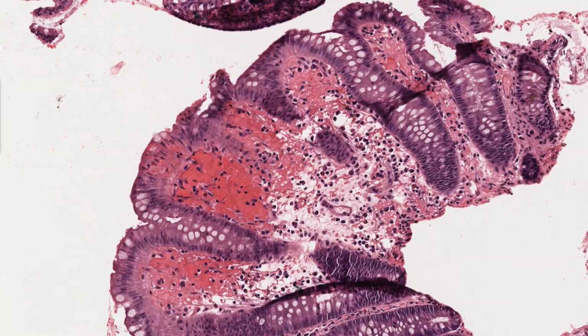Yes, we saw some focal areas of weathered crypts. We saw that the inflammatory cells are not increased. We saw some epithelial loss for the surface. We saw some collagenous stroma. We saw edema. We saw hemorrhage with blood cell extravasation. All of these collectively, when we see them, they are all clues, but you cannot use one on its own.